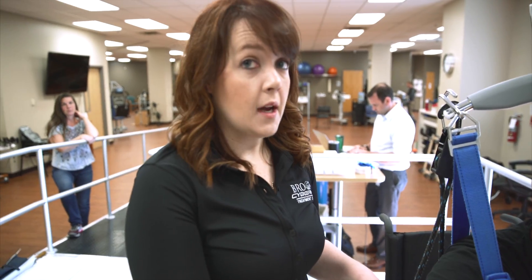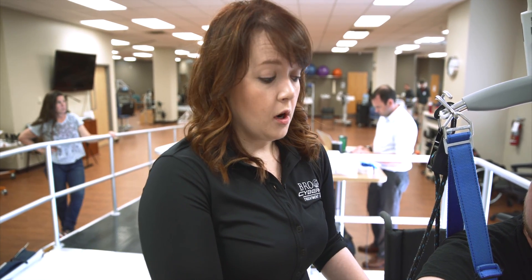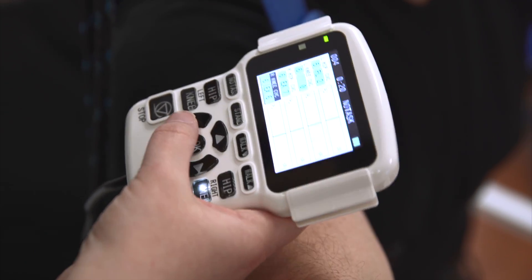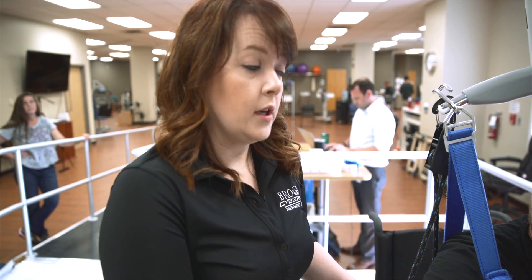One of the other big differences with HAL versus any other exoskeleton is that it can work on isolated movements, so someone can be sitting or standing and working on one movement at a time. What we're going to work on in a couple of minutes is Maverick working on lifting his leg up — really just working on those hip flexors to isolate them. Those are particularly important to be able to control the robot and the movement, since everything is based off of his signals. Him learning to control those signals and movements is a huge key in the use of this device.